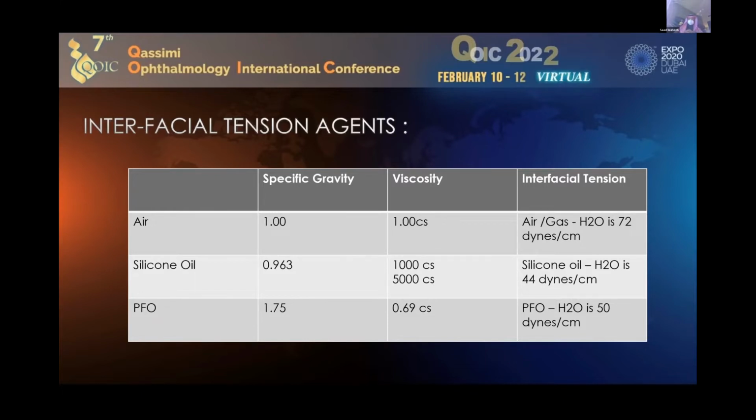And that's why some surgeons actually advise that if you have a redetachment under oil, to do the surgery under oil. What I usually do is I remove the oil and do the surgery and put oil again. But some surgeons advise to do that under oil because of this property. You lose a lot of surface tension when you put oil. So unless you've done good surgery on your membranes, the idea of using silicone oil can give you a false sense of security that you don't commonly see.